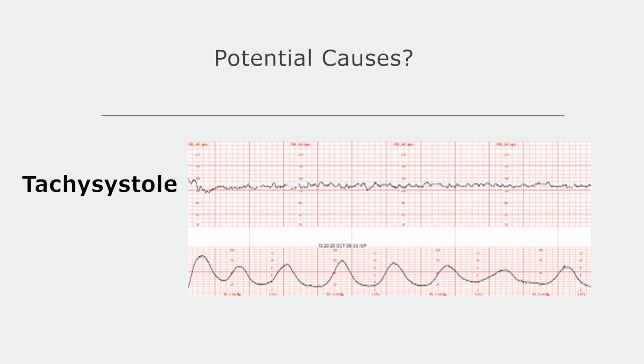One of the things you can do is give the patient an IV fluid bolus to space these out. Okay, she might be a little dehydrated. You can space out the contractions, okay, a little bit. But if she's truly having an abruption, yeah, you're going to see this kind of pattern.